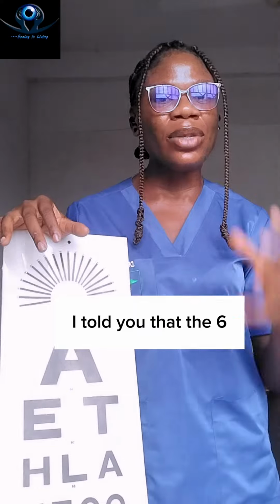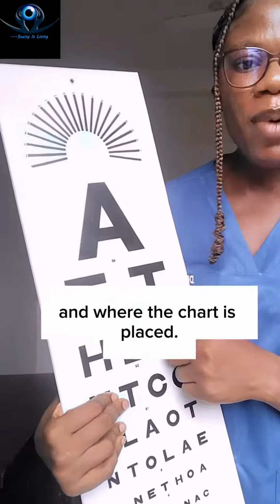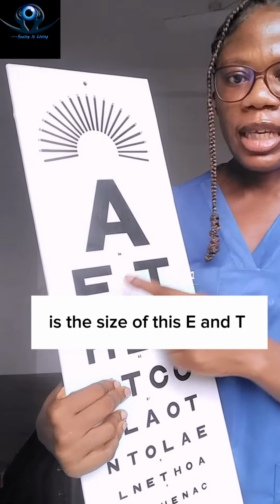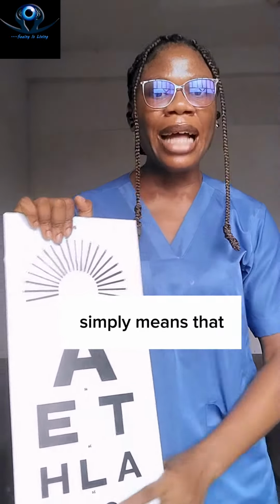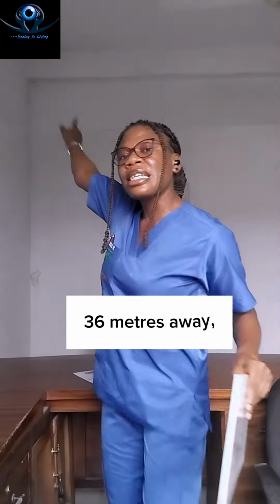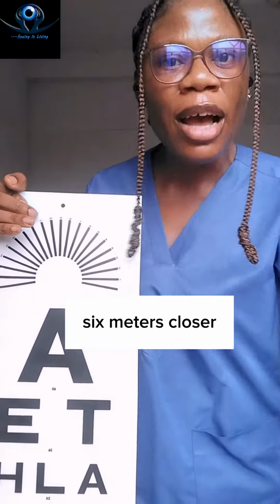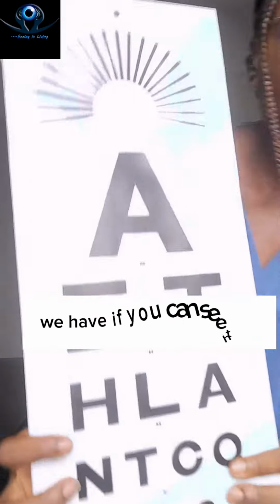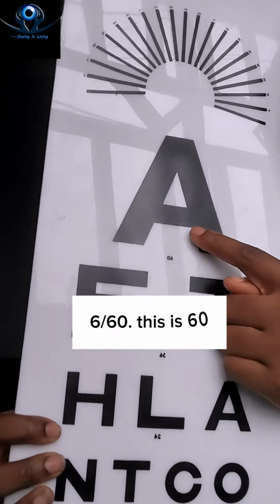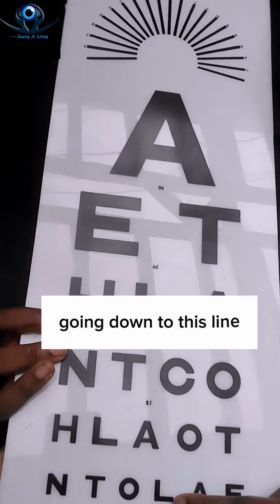Remember, I told you that the 6, which is the numerator, is the distance between where the patient is seated and where the chart is placed, while the 36 is the size of this E and T respectively. So reading 6/36 simply means that what an eye without any visual impairment can see 36 meters away, Obioha Obina needs to go 6 meters closer for him to see that same object. Going down, we have 6/24. We have, if you can see, 6/60. This is 6/60. This is 6/36. This is 6/24.